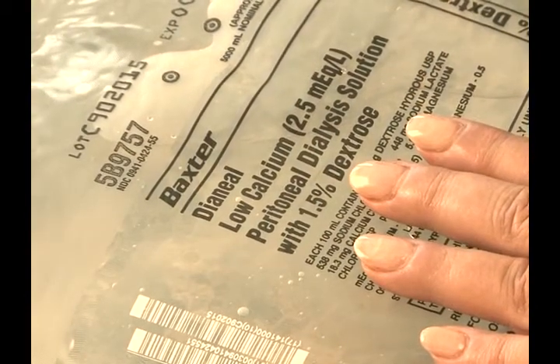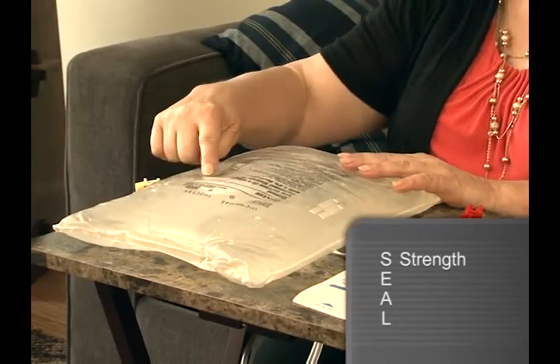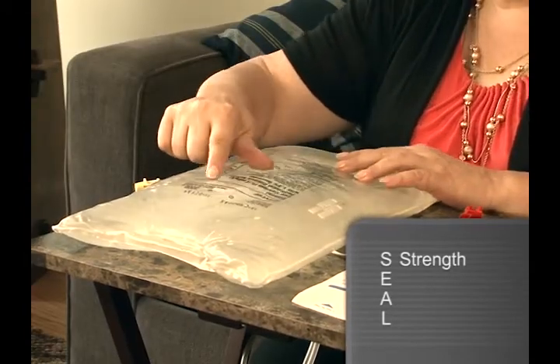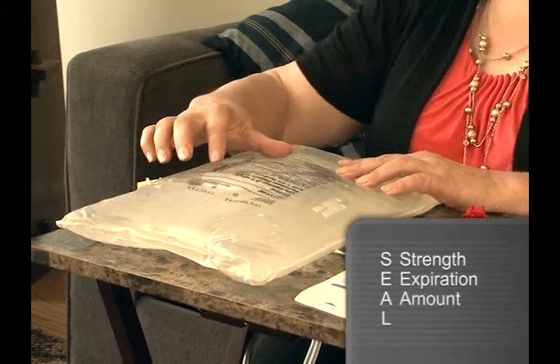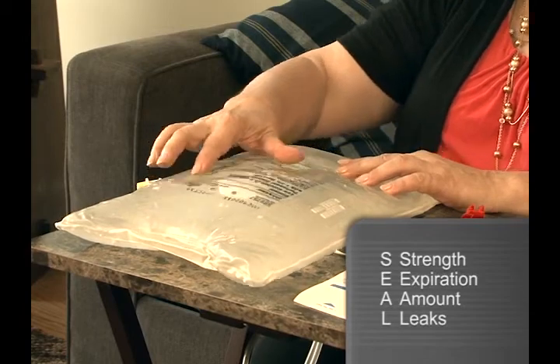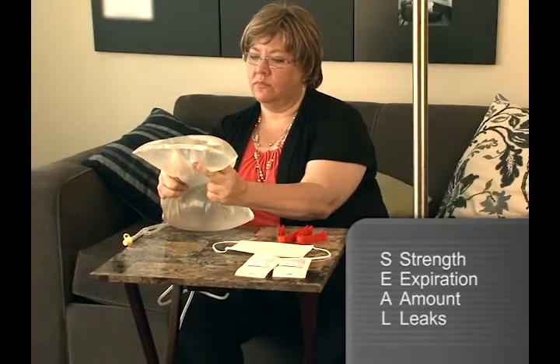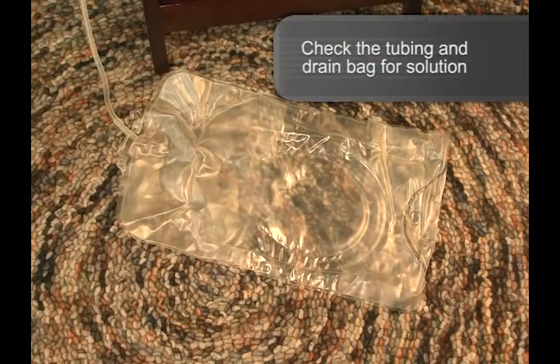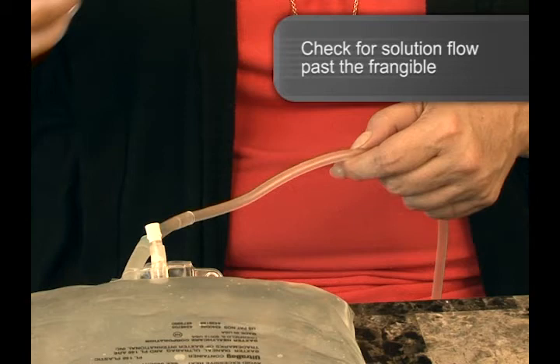Now, check the solution bag according to SEAL. S — strength of the solution concentrate. E — expiration date. A — amount of the solution. L — leaks. You can squeeze the bag to check for leaks or a broken frangible. Small droplets in the tubing or drain container are acceptable. But if solution flows past the frangible prior to use, or if leaks in the solution container are found, do not use and discard the units.